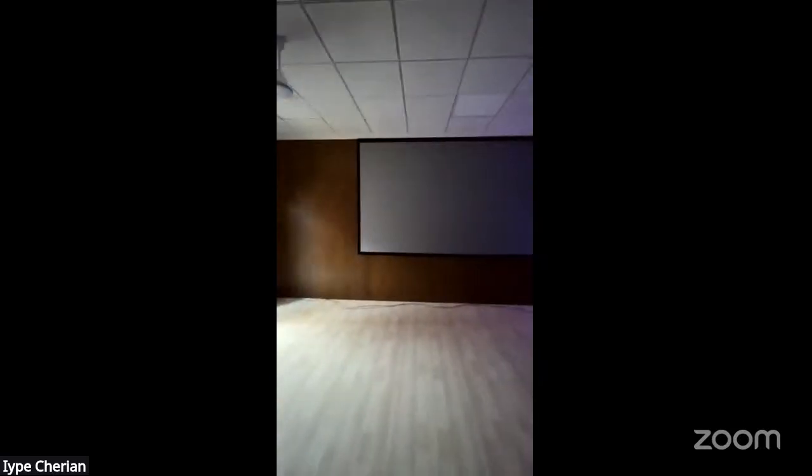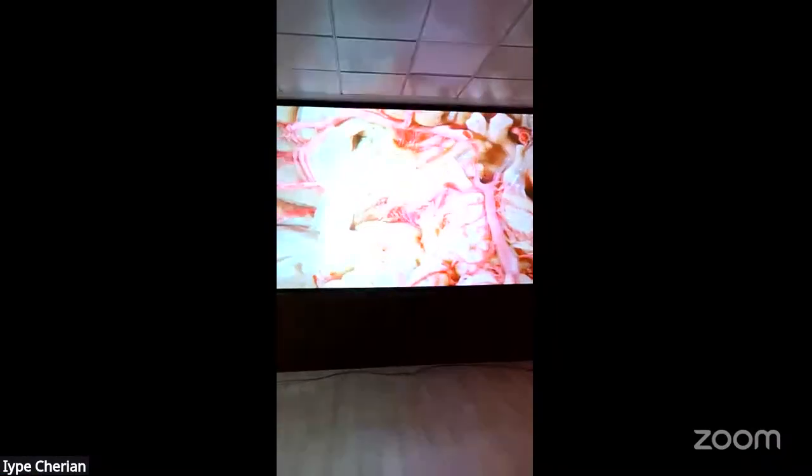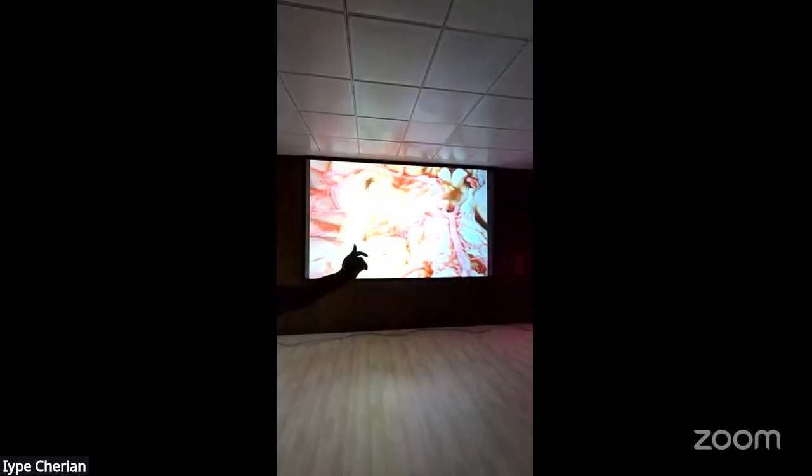आप चालू कर सकते हैं एक बार? Just wait, we'll show it. Neurosurgical TV वर जाते हैं. Can you connect? Oh, you, now that is an exoscope, more or less an exoscope screen. Yeah, it's connected to exoscope. Yeah, can you put on this? You can connect it now. Wow, Just John, wait that- for 1 minute. Oh, that is John, connected. please. Yeah, go ahead. Yeah, just 1 minute.